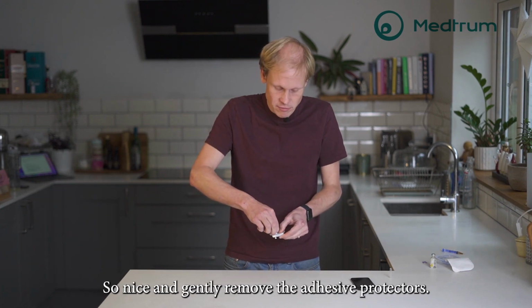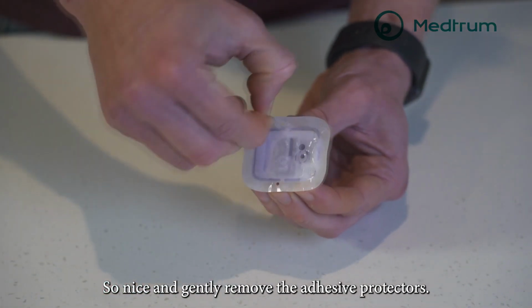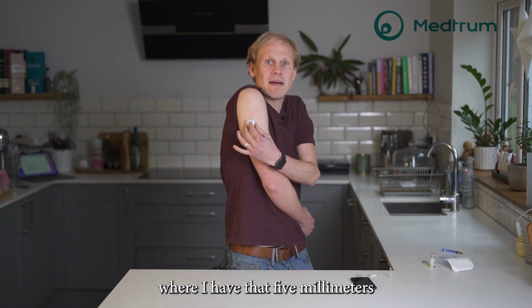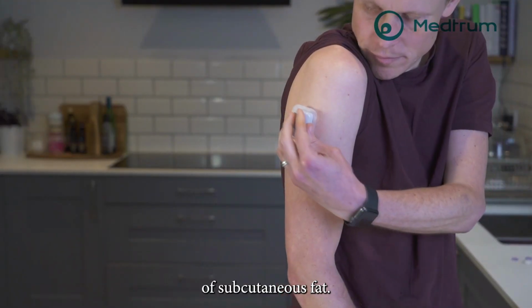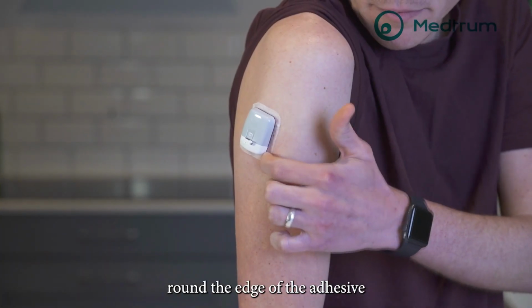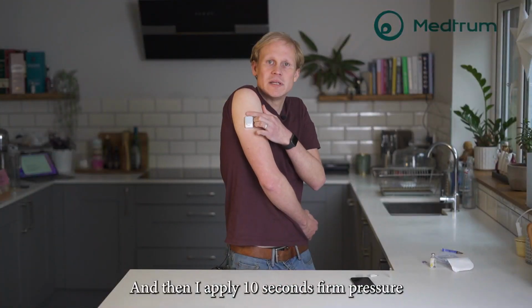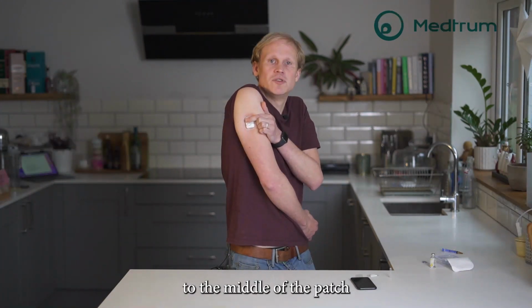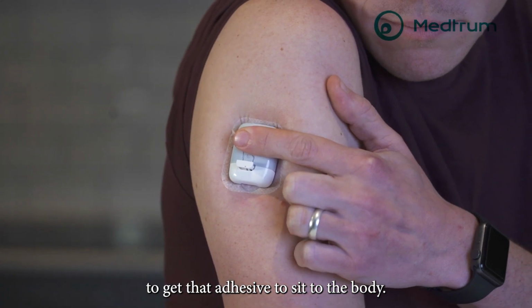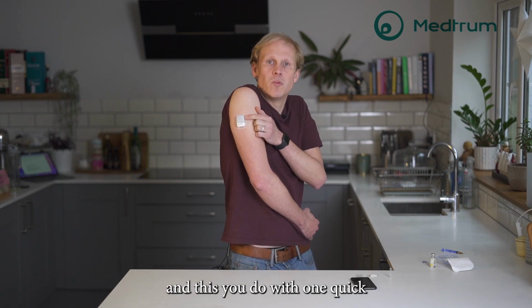So nice and gently remove the adhesive protectors. I'll be wearing mine on my arm, so I come round the back where I have that 5 millimeters of subcutaneous fat. I attach the pump to my arm. I run my fingers round the edge of the adhesive to make sure that's nice and stuck down, and then I apply 10 seconds of firm pressure to the middle of the patch to get that adhesive to set to the body.